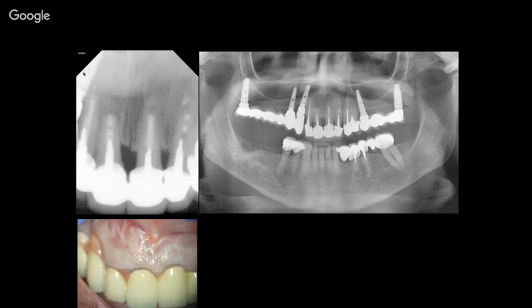And you can see on the X-ray that 4 of the teeth were treated surgically. On the PA, there is a kind of transparency, but on the panoramic, you can see that there is a lesion of endodontic origin on this central incisor. That tooth was causing pain for the patient. And because of her moderate financial situation, she preferred to treat only that tooth which was causing pain, and not go into the treatment of the whole segment.